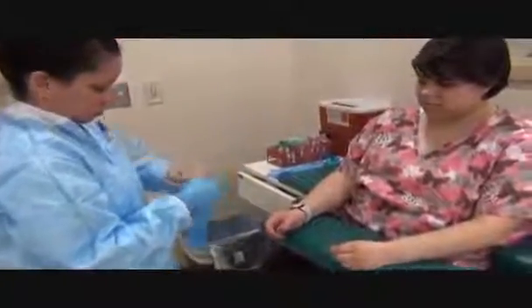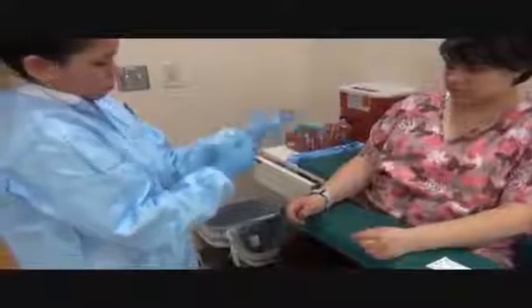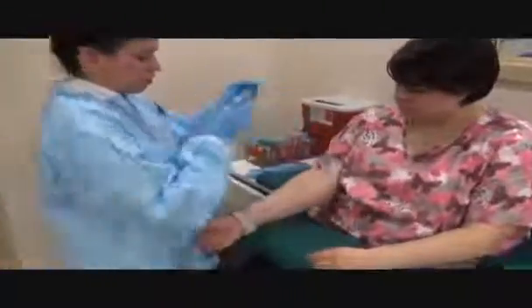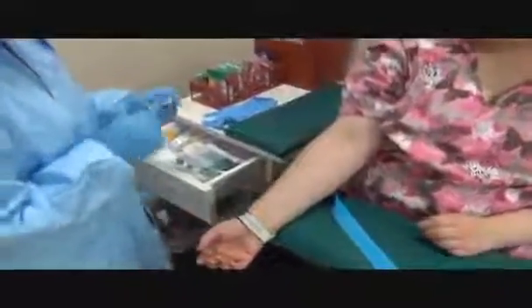Which arm? Okay, I'm going to take a look at this one. You want to tie the tourniquet at least four inches above the site. Make a fist for me. She has a good vein — it's right in here, you just can't see it. So I'm going to pick a landmark. I'm going to open up your hands. Clean it with alcohol: wipe once, flip it over, counter-clockwise circles.